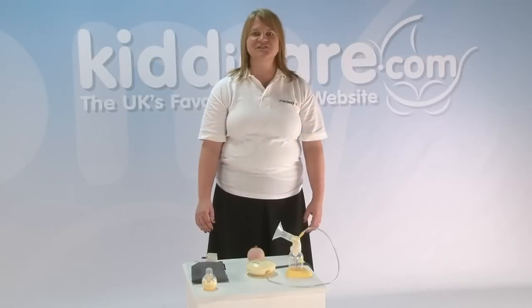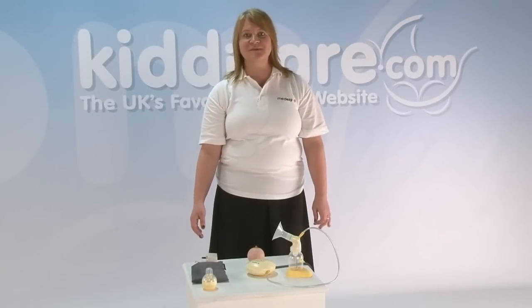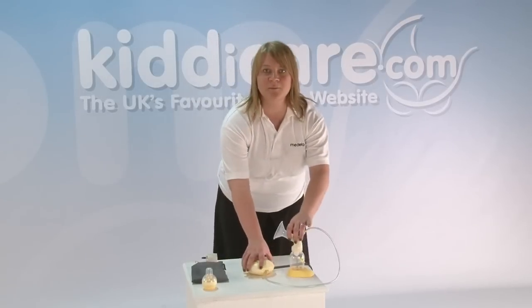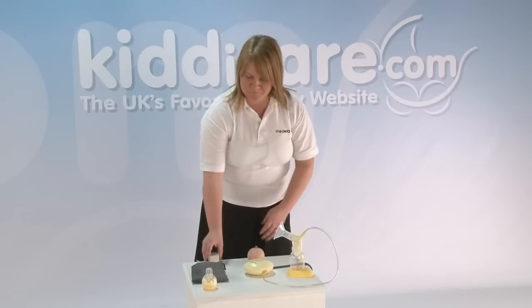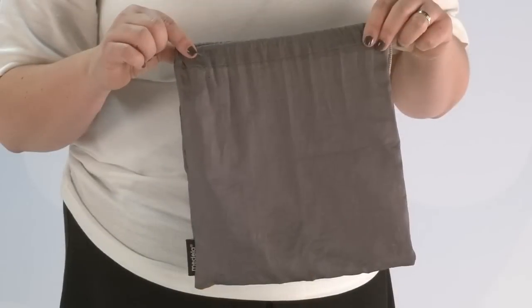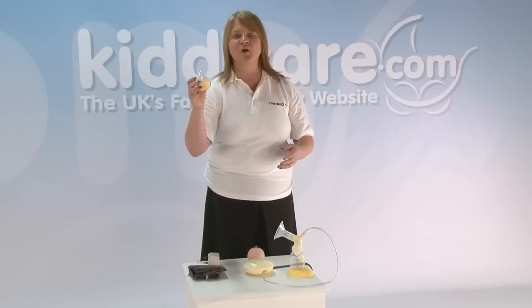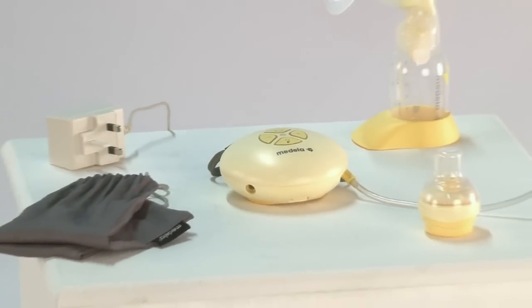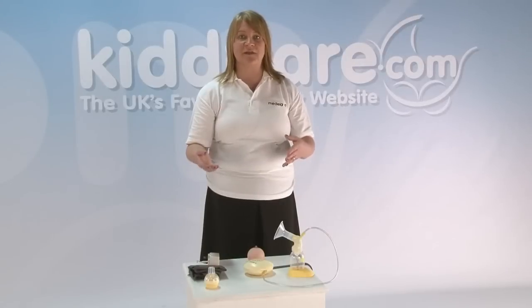Hello, I would like to introduce to you today the Swing Single Electric Breast Pump from Medela. In your packaging you will see you get the complete breast pump unit, the mains adapter, a drawstring bag to carry it about with you, and the Calma top feeding device for expressed breast milk. I'll run through all these items with you and show you how they are dismantled and put back together and how they work.